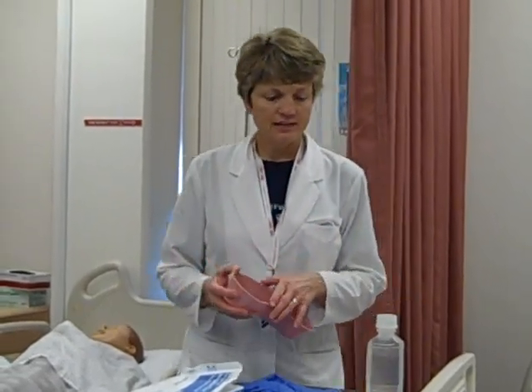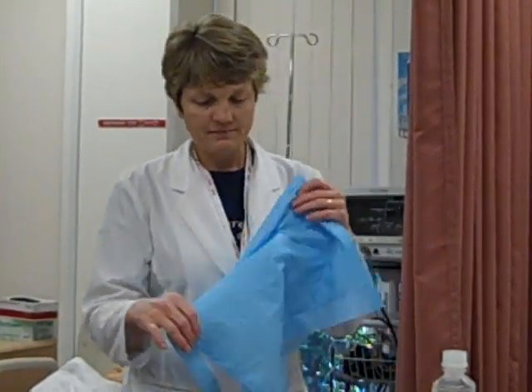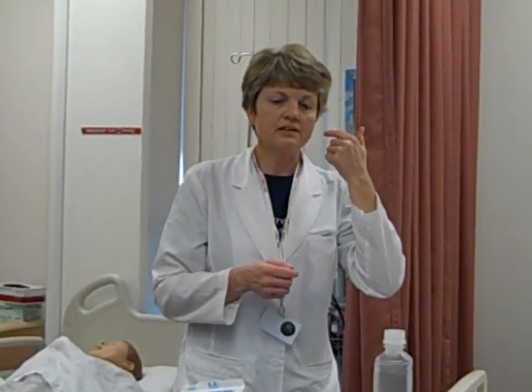You're going to need a kidney basin to catch the irrigating solution, and some kind of drape for protection of the patient. You should always consider bringing in some sterile gauze pads or cotton balls, because sometimes there's drainage on eyes and you might have to clean it before you irrigate. You're also going to need an irrigation tray set.